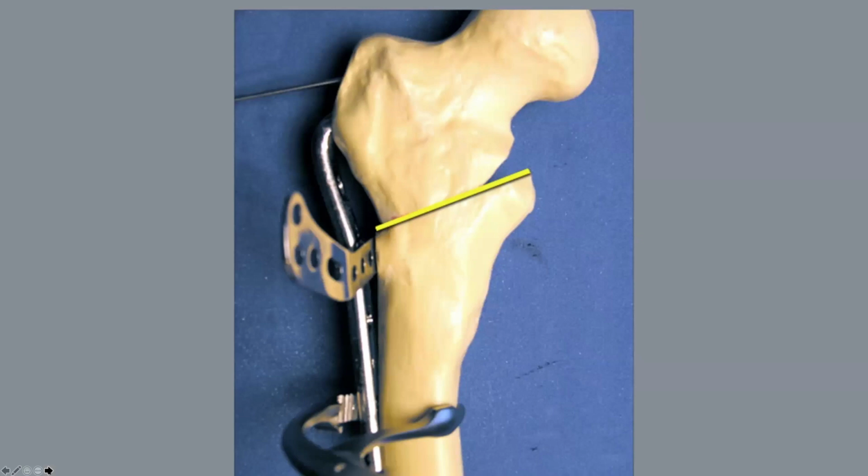As Keith mentioned, this is an extremely important point. And if you don't know how to do offset correction, you have to learn how to do it before you do this operation. Because you have an oblique slope here. And if you have a 120-degree blade plate sitting up into the femoral neck here, and you put the articulating tensioning device on the end of the plate here and you pull on it, theoretically, you could pull this blade out of the bone. And it just is not the way to achieve compression across the osteotomy site. This technique of offset compression is.